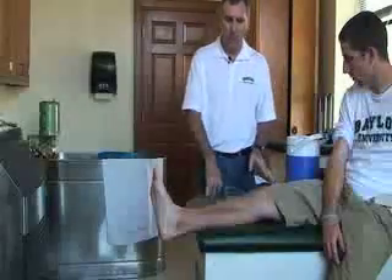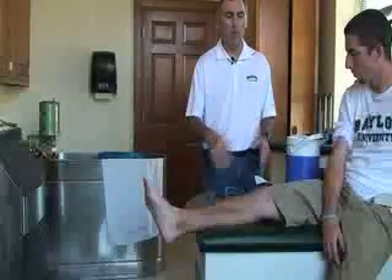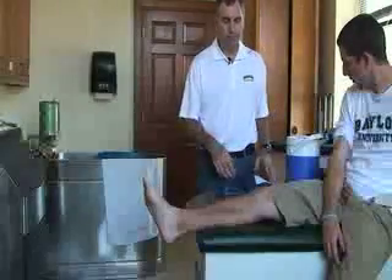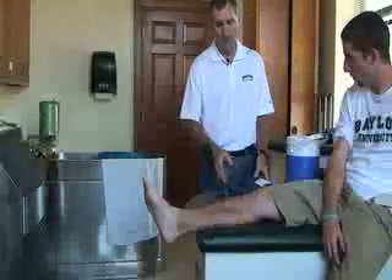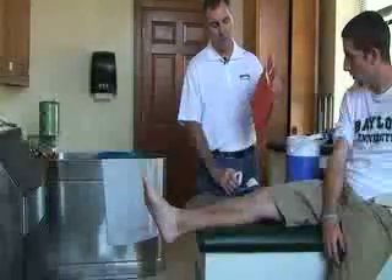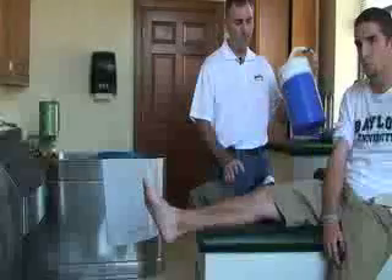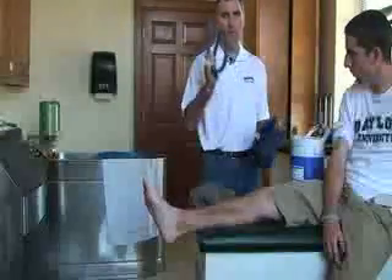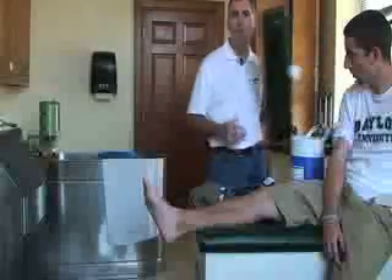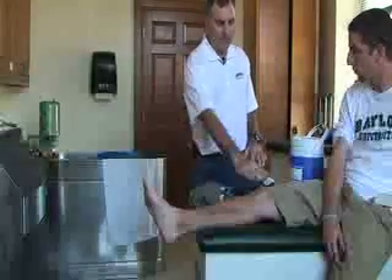Next we're going to do a cryo cuff treatment for an injured knee. After we inspect it to determine the indications, we also want to make sure there are no contraindications — such as an allergy to cold — and that this is an acute injury or has inflammation. We're going to gather our equipment: a timer, a towel, the cryo cuff unit with the tube, and the knee attachment. There are also ankle and shoulder attachments available. We'll also need something to elevate the knee.